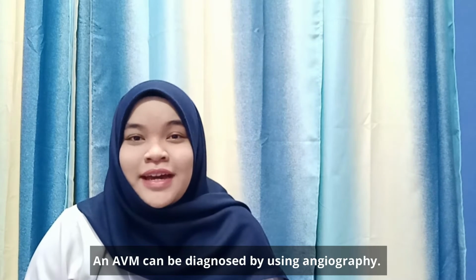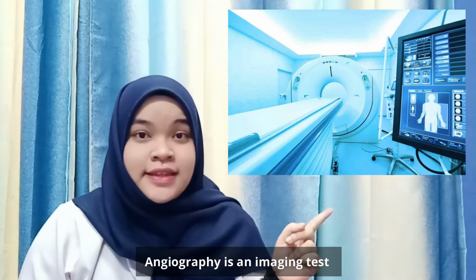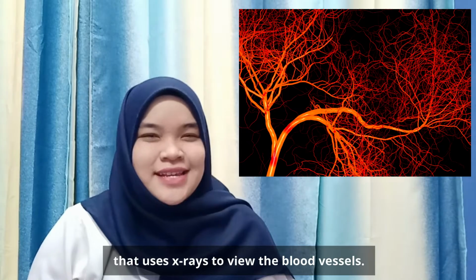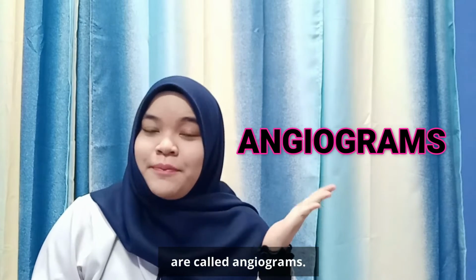An AVM can be diagnosed by using angiography. Angiography is an imaging test that uses X-ray to view the blood vessels. The X-ray images provided by an angiography are called angiograms.